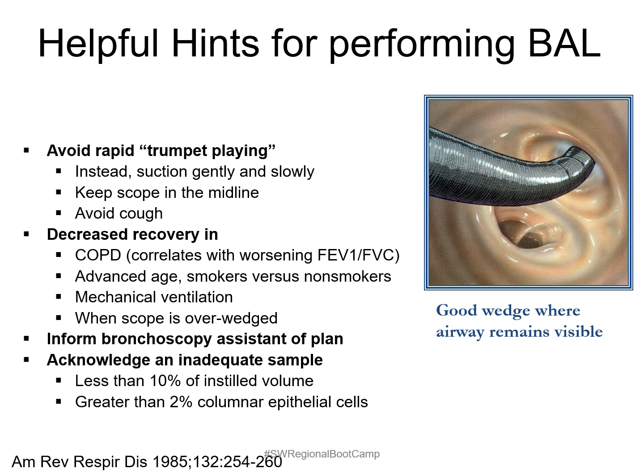Lastly, it's important to recognize when you have an inadequate sample. During the procedure, you should recognize this if the return is less than 10% of the instilled volume. Alternatively, more than 2% columnar epithelial cells will also signify an inadequate sample.